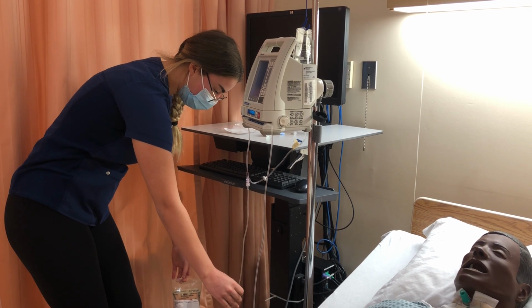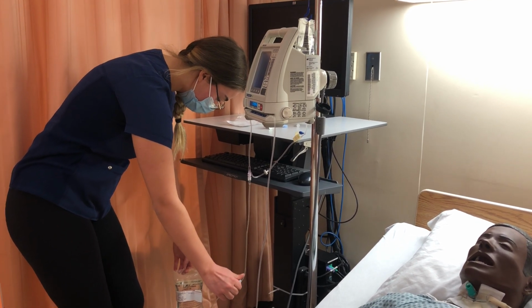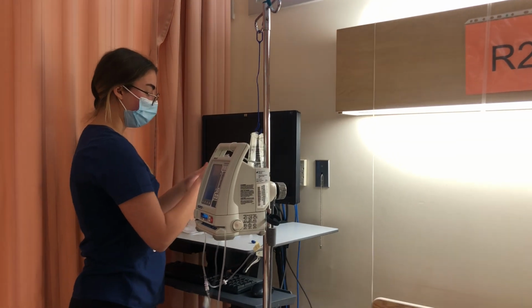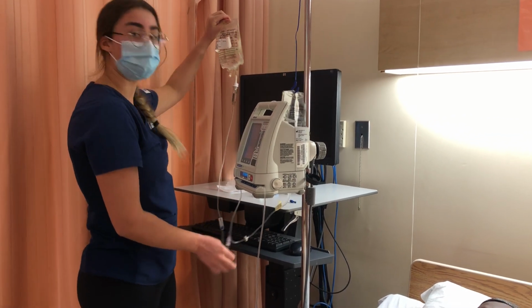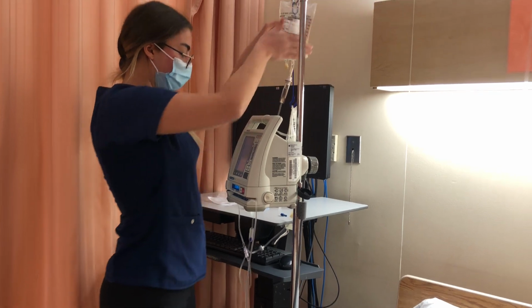And we're going to go ahead and swab the tops of these vials. I'm going to swab this one, and swab for 30 seconds. So I'm just going to see that my drip chamber is filled to a half to a third, so I have a little bit too much here. That's better. Okay, and I'm going to inspect my tubing to make sure there's no bubbles, which there isn't, so I can hang my bag.